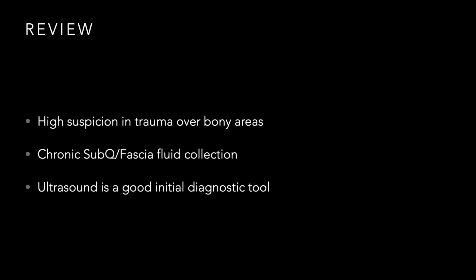And so they definitely need some surgical involvement, either at the front end for management recommendations or eventual percutaneous or operative drainage, right? And finally, ultrasound can be a good initial diagnostic tool when you have this concern. When you're like, I don't know if I want to pull the trigger on a CT scan just yet, you can go to the bedside with the ultrasound, look and say, do I have that characteristic fluid collection in that area? And that would suggest this lesion.